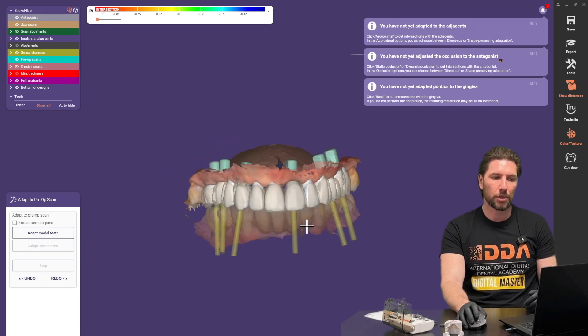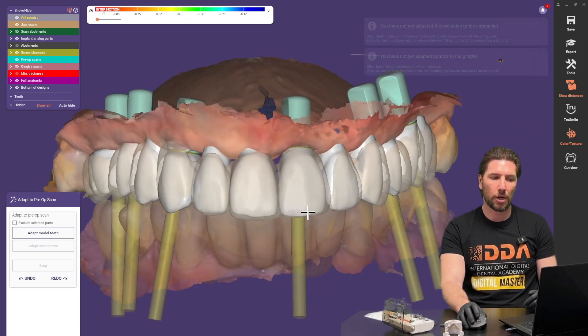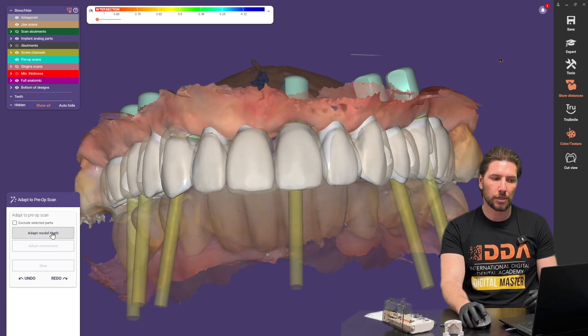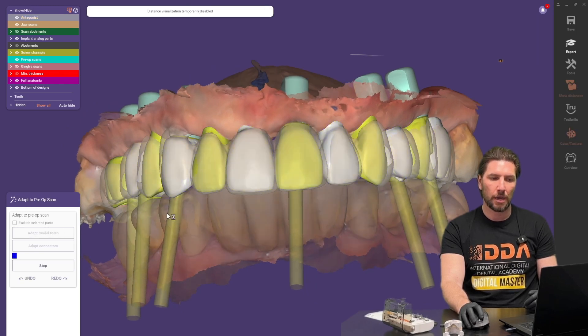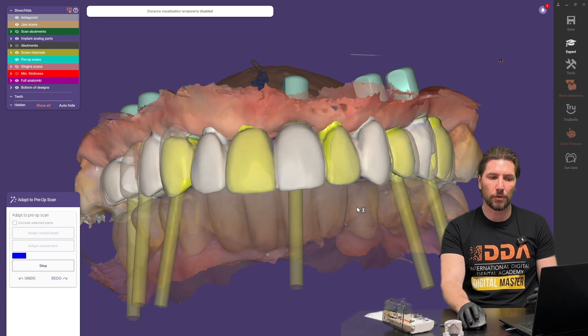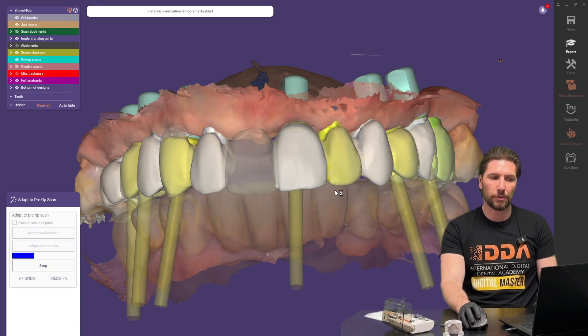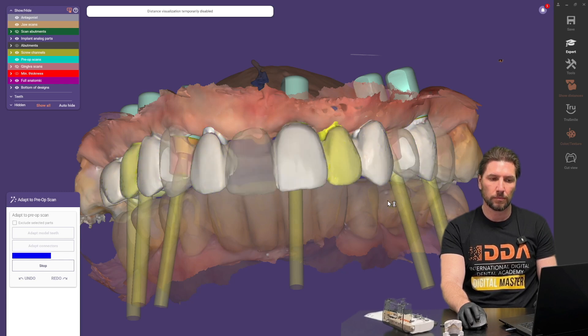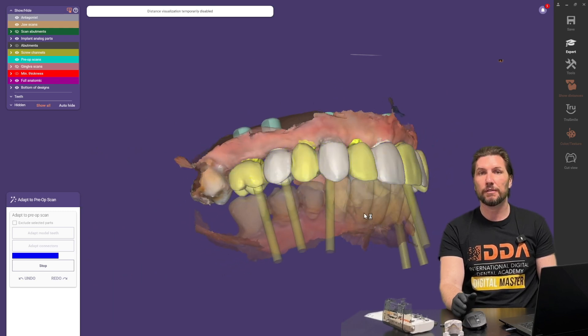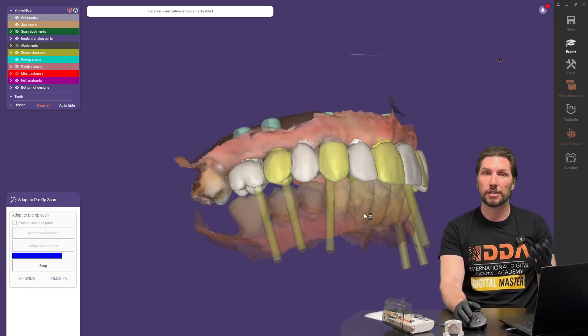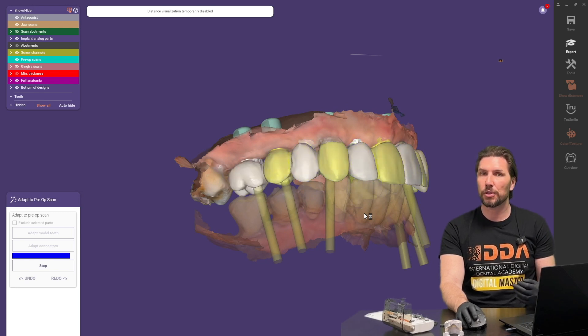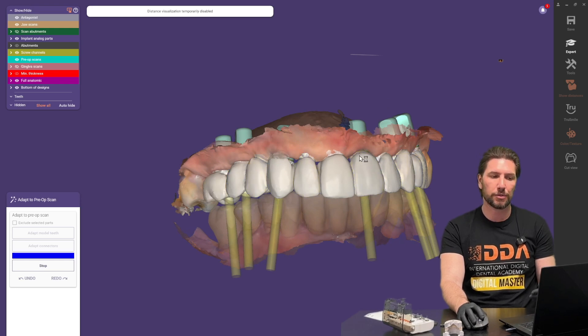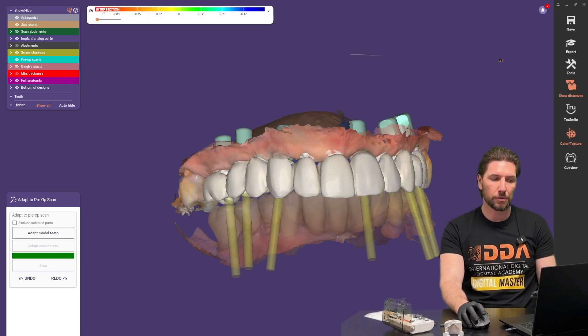So because we're happy with that provisional now we're going to copy this so we're just going to click adapt model teeth and it will change the shape of those teeth to fit in with this provisional that we've got in place. So this means that if you've got a patient with a provisional or a denture or partial denture and you're happy with the shape of those teeth you can align this and obviously spend the time then just adapting to how it's going to fit onto the soft tissue.